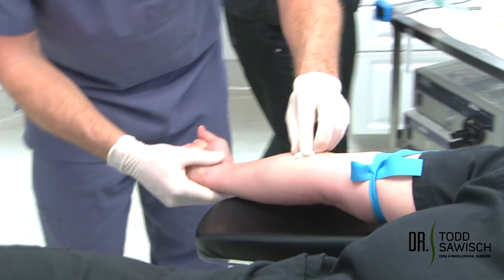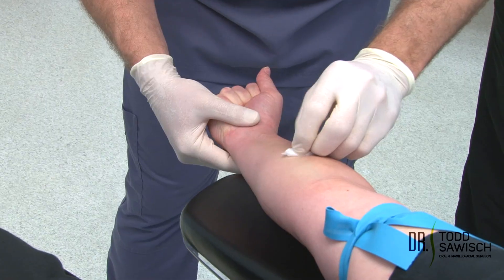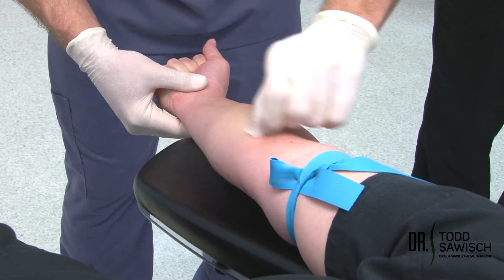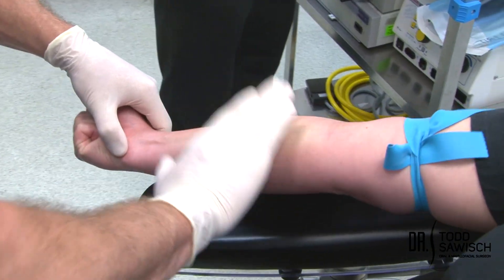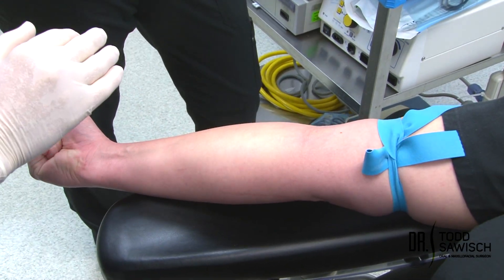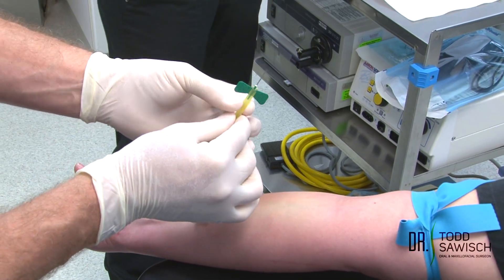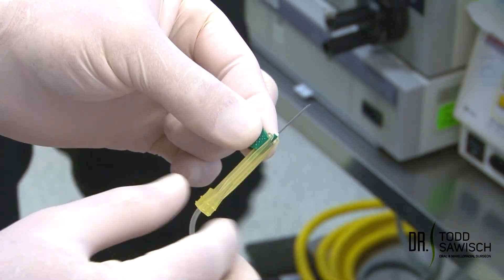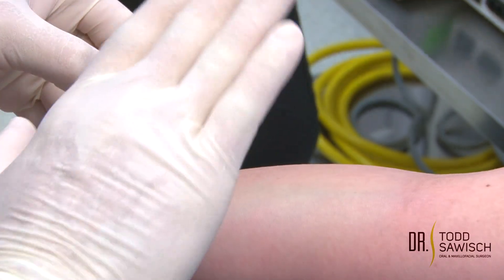I'm going to take an alcohol pad and cleanse this area. You can see the patient has some decent veins. With the butterfly, there are some rippled edges — the purpose of that is to grab these wings so that your thumbs and forefinger are on the ripples, which creates the bevel to be up.